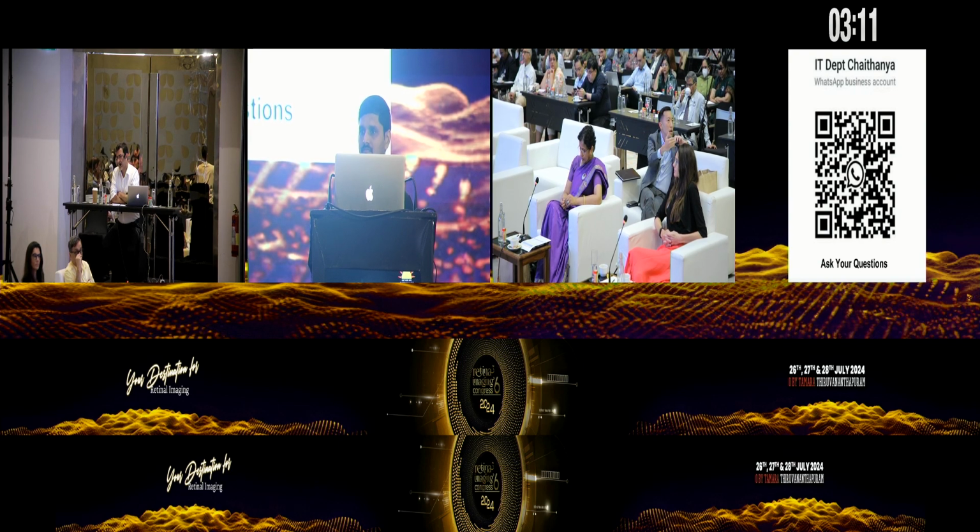Obviously, if there's no flow on OCTA, it doesn't mean that it isn't there. It could just mean that your OCTA is not giving you the good resolution to pick up the MNV. Then I'll continue to follow up with OCTA until I detect anything.